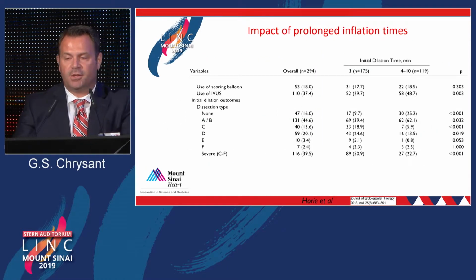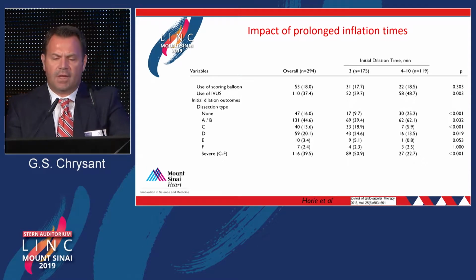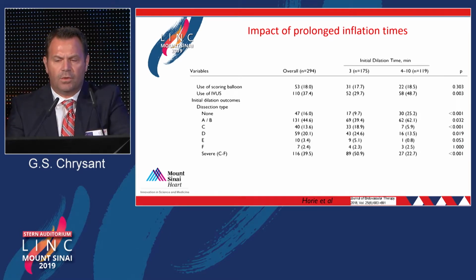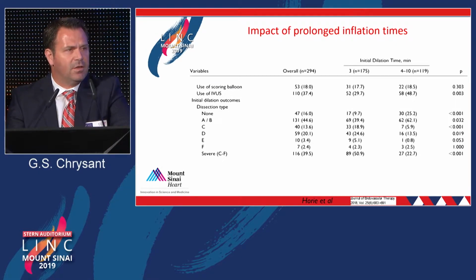What about inflation times? If you leave the balloon up for a long time, does that matter, or short time? So it turns out that if you look at the C through F dissections in total, if you had a balloon time of 4 to 10 minutes, and I think PK was just saying he was going to leave it up for 8 to 10 minutes, then that also showed a significant improvement in your chance of having a severe dissection. So long balloons, long inflations help.